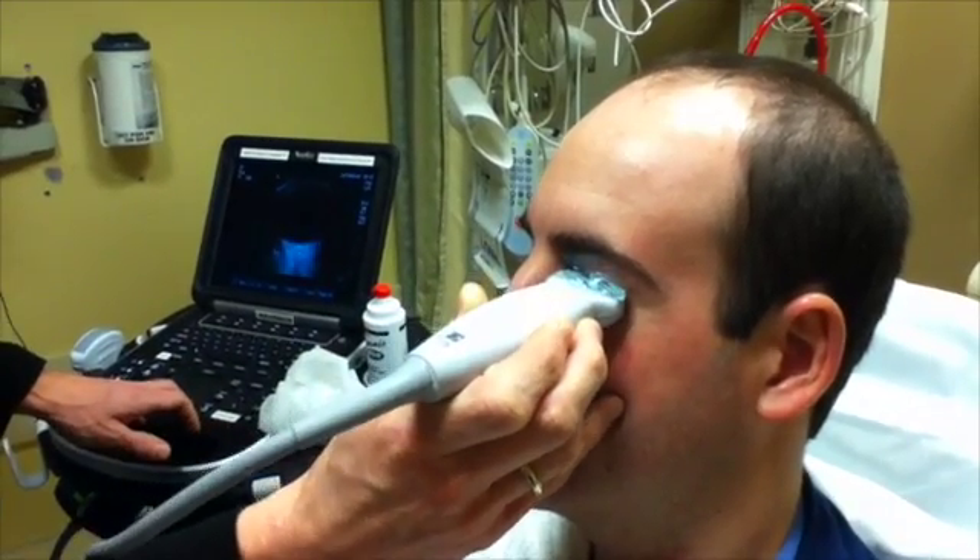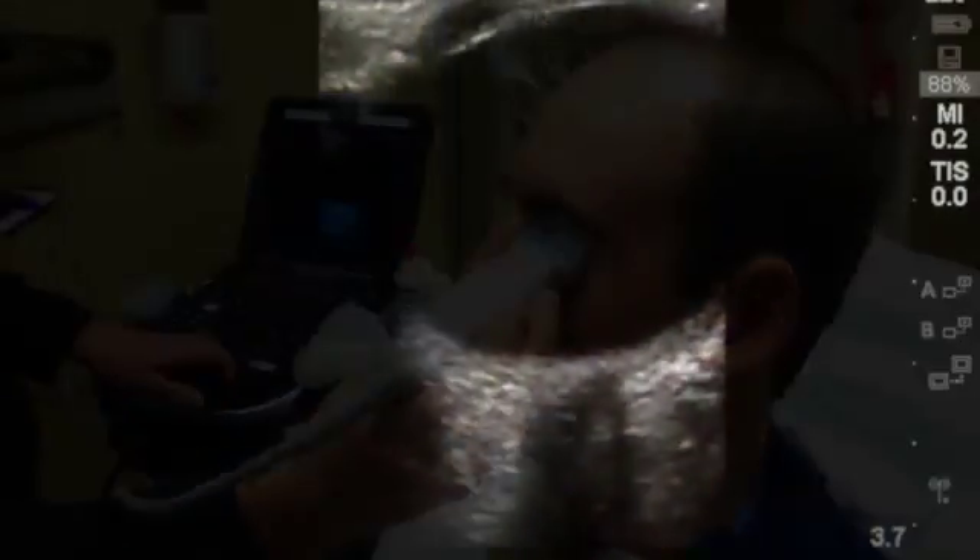You can also have the patient look up, down, left, or right to assist in fully evaluating the orbit.